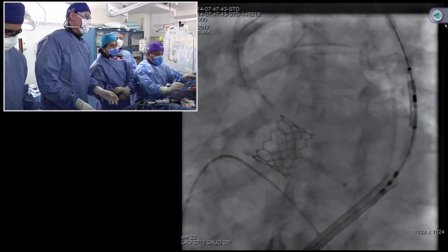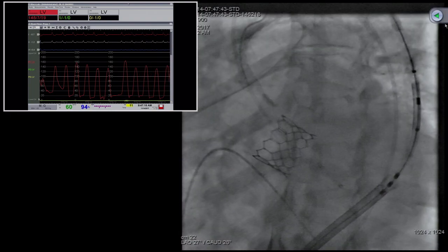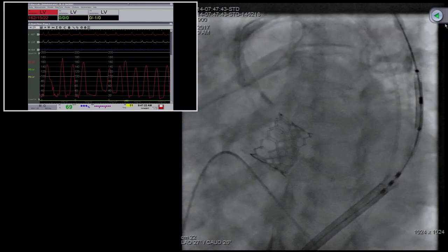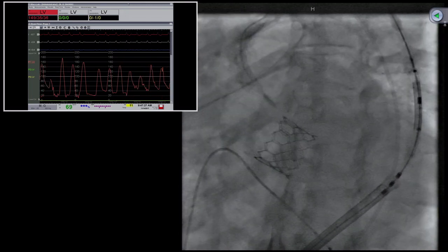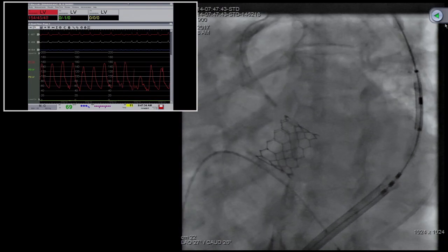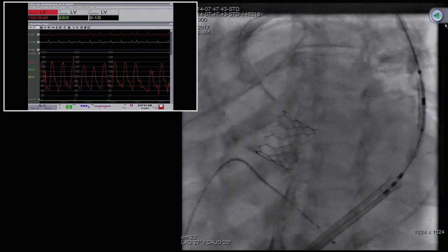All right, let's go to hemodynamics. Technique of pullback. Let's let it stabilize a little bit. Okay, a pullback now. Fluoro. Good. No gradient. Zero. Good, but we do one aortogram. It came back up. Come back a little bit. It went all the way. I don't know where it is. Here. Nice. It's coming out. Okay, good. Beautiful.